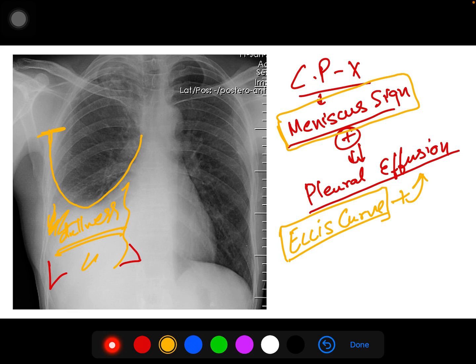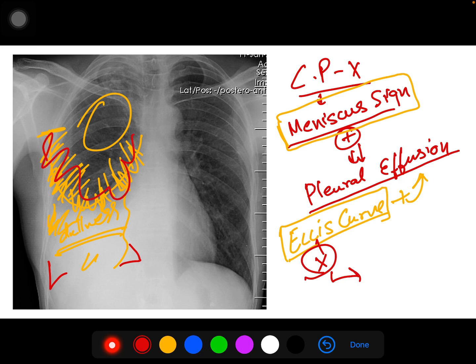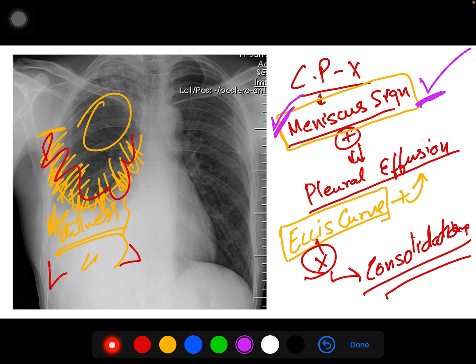I will show the significance of Ellis curve in further pathology. One more thing — if the demarcation is not clean, if there is haziness in that area rather than a clean curve, then it is suggestive of consolidation. But here it was clean, and you could see a clean curve going towards the axilla — which is obviously Ellis curve. Ellis curve is only seen when there is highly accumulated fluid. The main catch here is the meniscus sign — whenever meniscus sign is positive, it's pleural effusion.